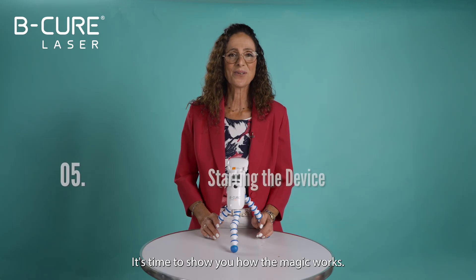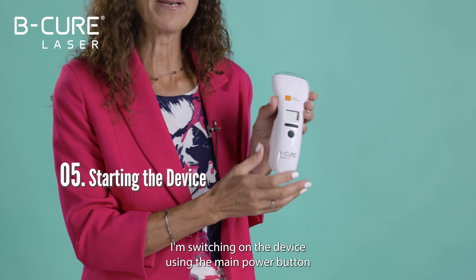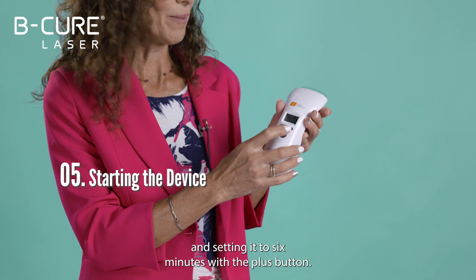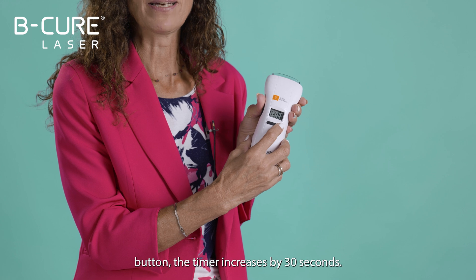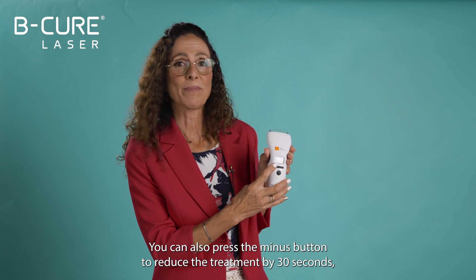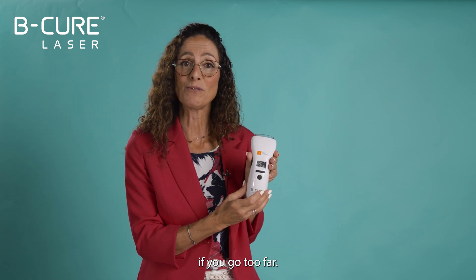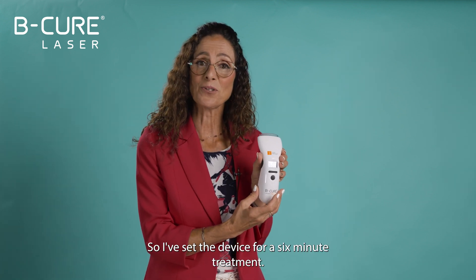It's time to show you how the magic works. I'm switching on the device using the main power button and setting it to six minutes with the plus button. Every time I press the plus button the timer increases by 30 seconds. You can also press the minus button to reduce the treatment by 30 seconds if you go too far. So I've set the device for a six-minute treatment.